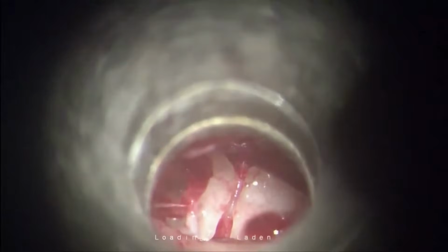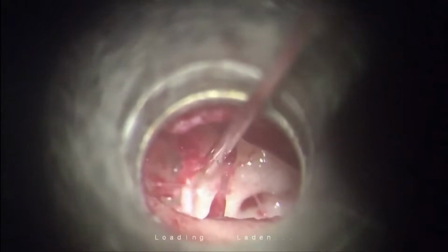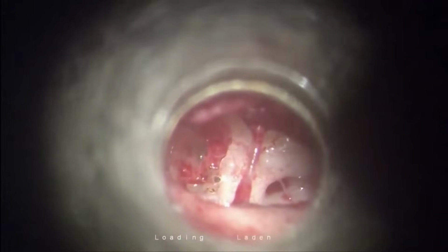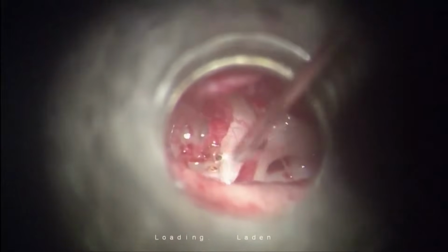Yes, very well. So this is the most simplified version with this laser, which we have already shown so many times. So what I am doing now, first with this beam, I am going to vaporize this tendon. I am not doing a reverse stapedotomy since I am having this laser. So now I have no insecurity regarding mobilization of the footplate or anything. See this? Yes sir. In a couple of shots, our tendon is vaporized. Now my next step, you can see the posterior crust like Ashish mentioned. Absolutely vertical. It is not giving the appearance of an arch.